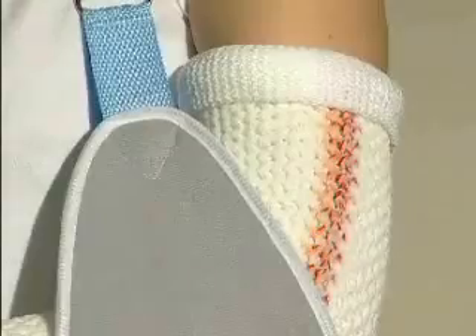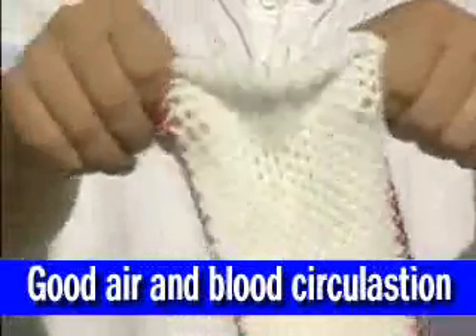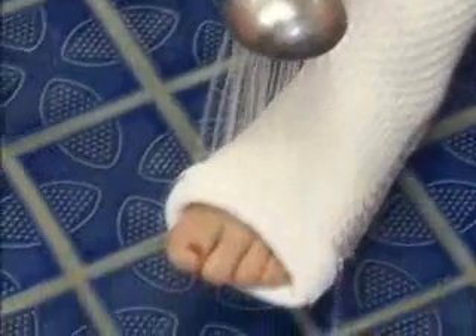Have you ever been inconvenienced by old-fashioned casts that were too constricting and caused poor circulation? The HM cast is constructed using special fabrics that allow unrestricted circulation. In addition, after wearing this cast in the shower or in the pool, the special fabric dries naturally and quickly, freeing you from itch, odors, and secondary scars.